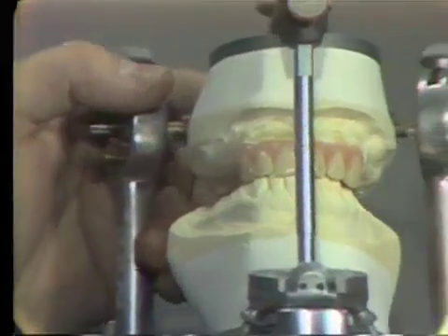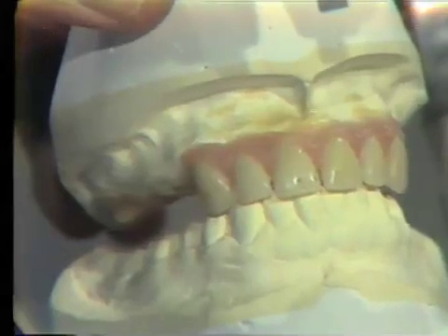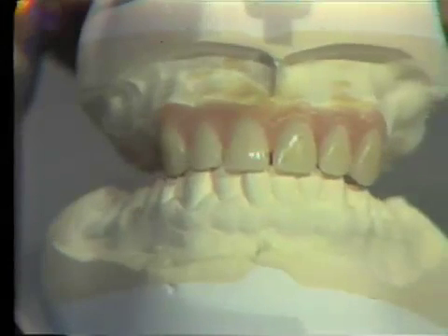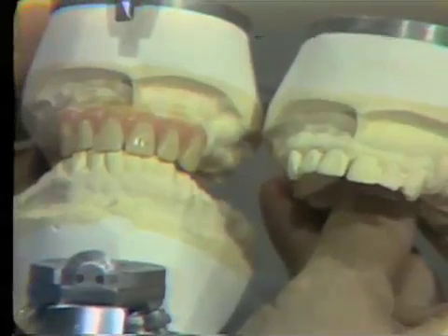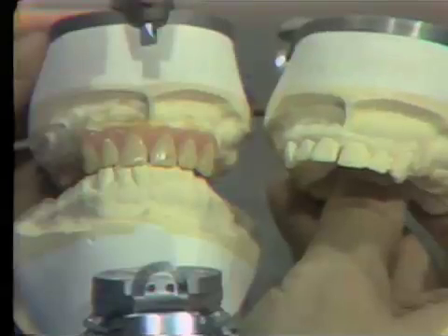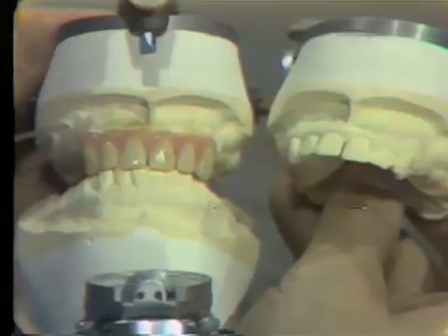After one side has been set, the opposite side can be set similarly. I'm going to lift up the incisor pin here so that you can see the anterior setup. We have restored the shape, angulation, and incisor edge contour of the natural teeth. We have also restored the gingival crevice and gingival cuff area in wax with our wax-up. We can compare this to a duplicate cast of what the teeth looked like before they were removed, and you can see that we have a very similar aesthetic arrangement. After the anterior teeth have been set, we are then ready to start setting the posterior teeth.